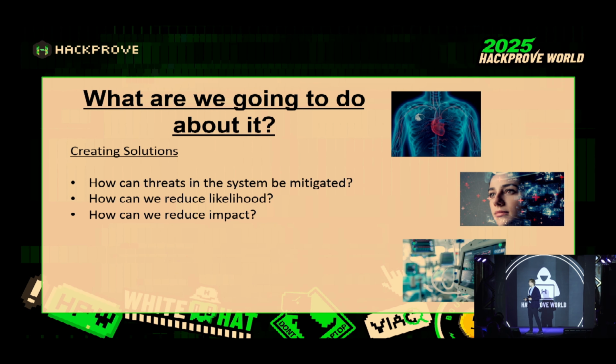The way to go about reducing that impact is, for example, you could encrypt all the data in the database. Use something super strong, something they won't be able to crack, and then, sure, the vulnerability is still there. There is a vector to get into that database, but the impact is not going to be the same. So that's going to come down pretty heavily.